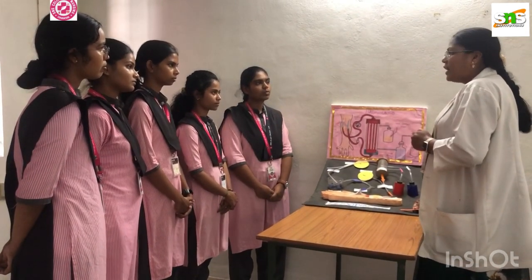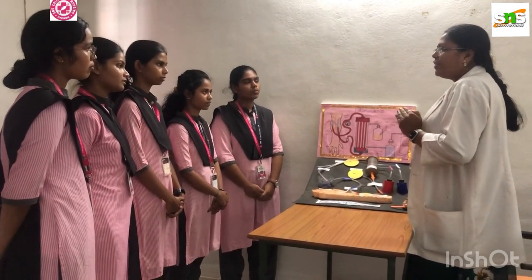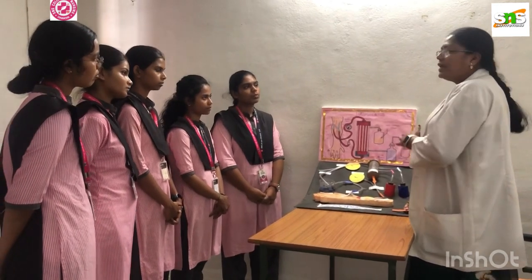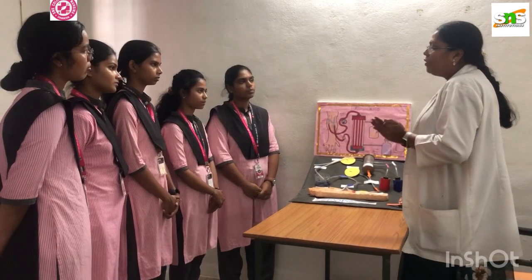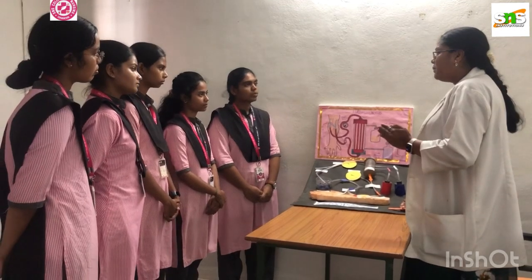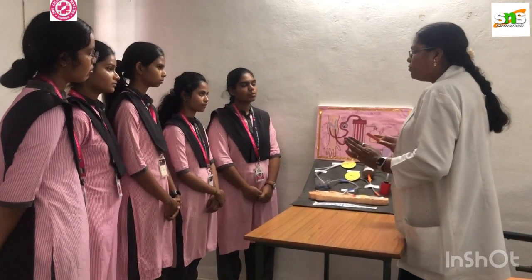What is hemodialysis? Dialysis is a machine which is used to remove the waste products from the blood. The kidney's role is taken up by an external machine, like a mechanical ventilator. Just as the lungs' action is taken up by the mechanical ventilator, this dialysis machine takes up the role of the kidneys. So how does the system work?